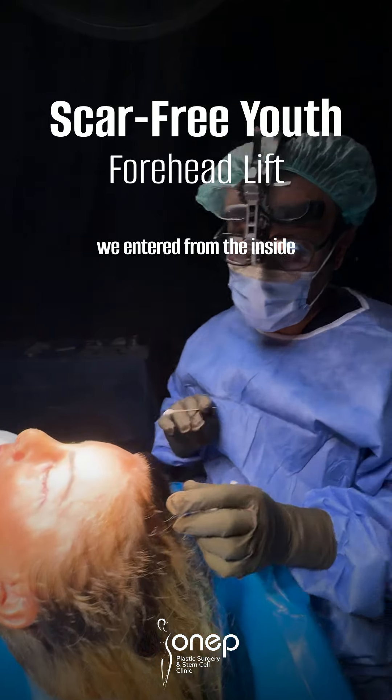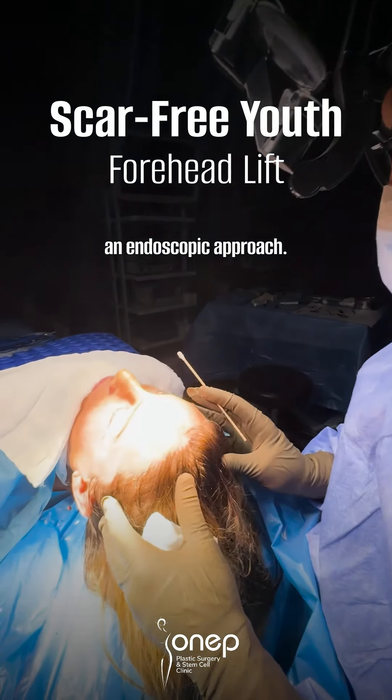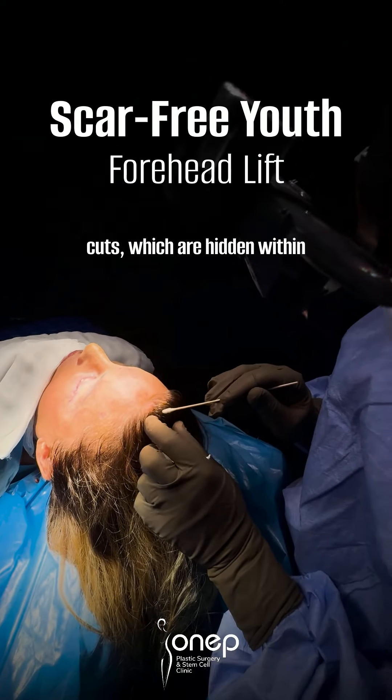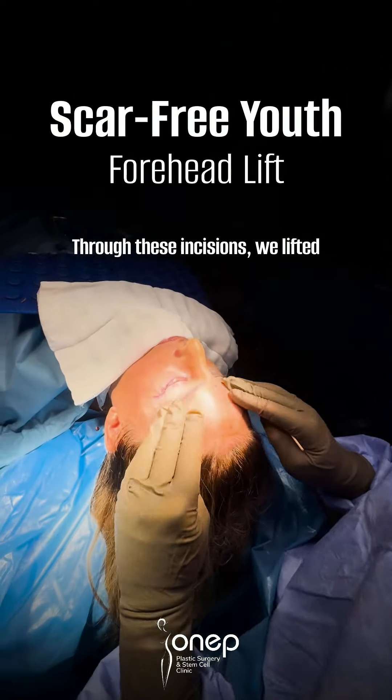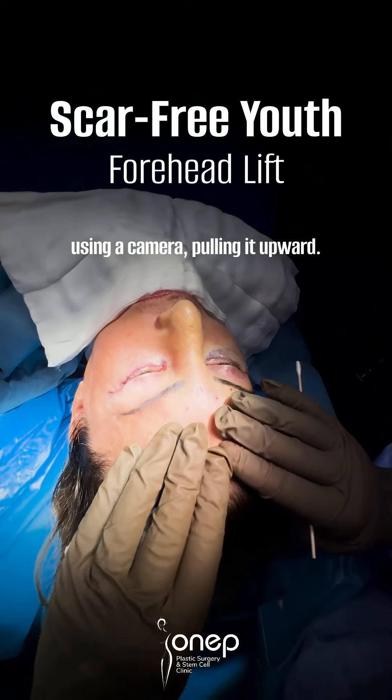For this forehead lift, we entered from the inside of the hairline, right here, with an endoscopic approach. Our patient has small incisions within the scalp — tiny little cuts — which are hidden within the hair, so they're not visible. Through these incisions, we lifted the entire forehead internally using a camera, pulling it upward.